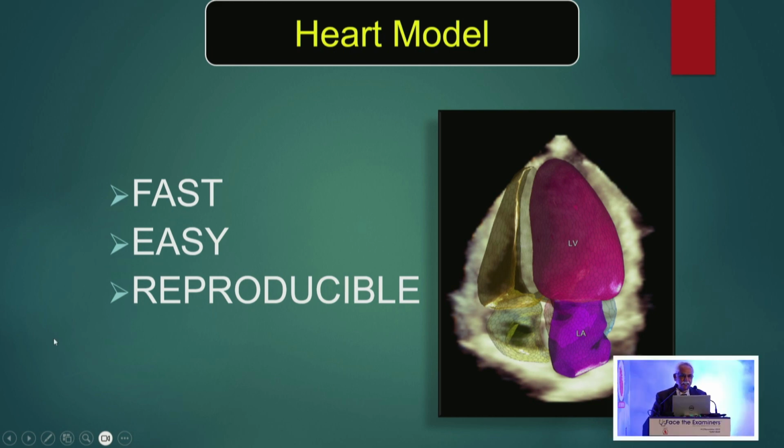The next one is, how about using artificial intelligence? This is one artificial intelligence model, the Philips three-dimensional echocardiographic method. It automatically detects the endocardium, and they have fed a large amount of data into it. From the three-dimensional echocardiogram, the machine itself immediately produces a cast of the left ventricle and calculates the left ventricular diastolic volume and the systolic volume.